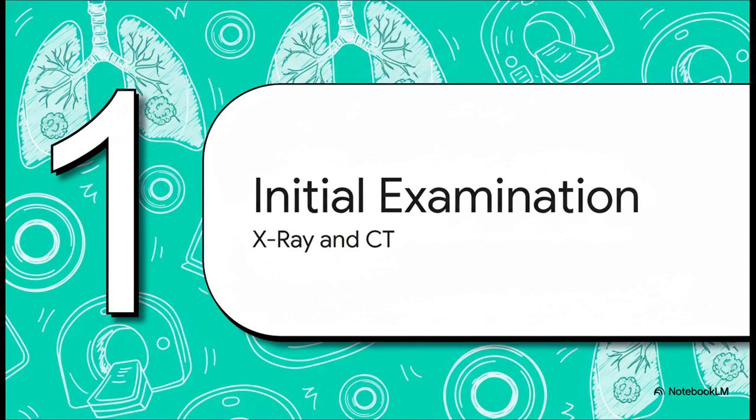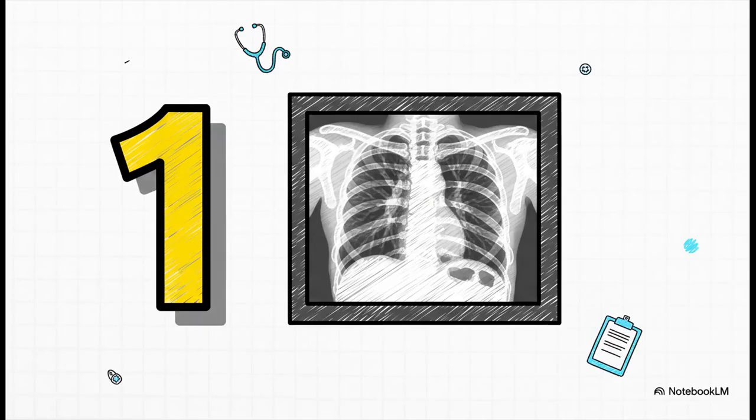So when a patient's symptoms have you worried, these are the first tools you're going to reach for. Yep, the journey almost always kicks off right here with a good old-fashioned chest X-ray. Why? Well, it's everywhere, it's quick, and it is the officially recommended first-line investigation. It's basically your go-to triage tool before you decide to bring out the bigger, more advanced imaging guns.